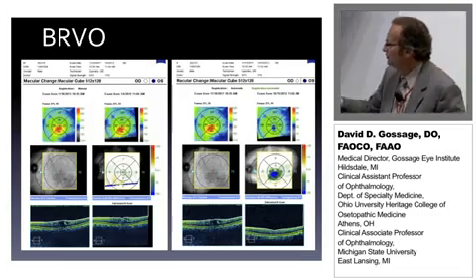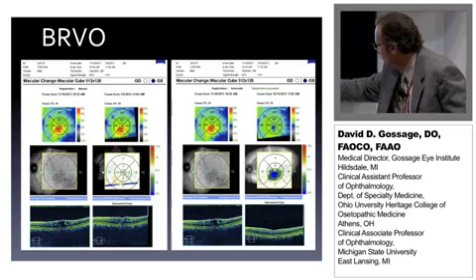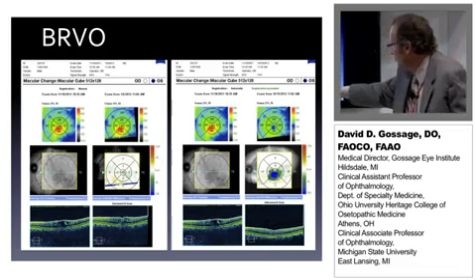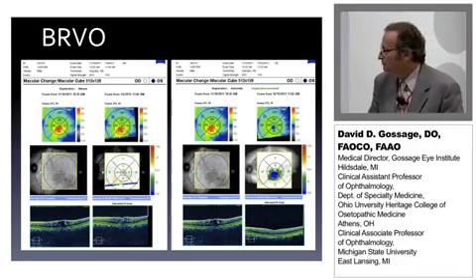And here's a transition of the different OCTs. You can see with the lower power setting, we did have some resolution, but with the higher power setting, comparing the pre-treatment OCT with the post-treatment OCT, we can see marked improvement of that macular edema, so pretty impressive.